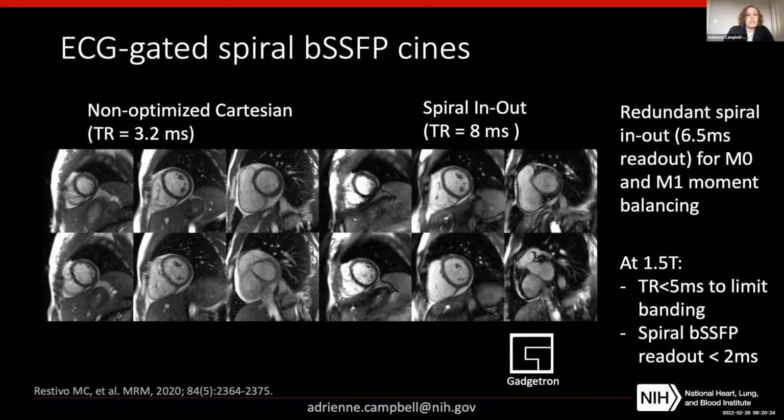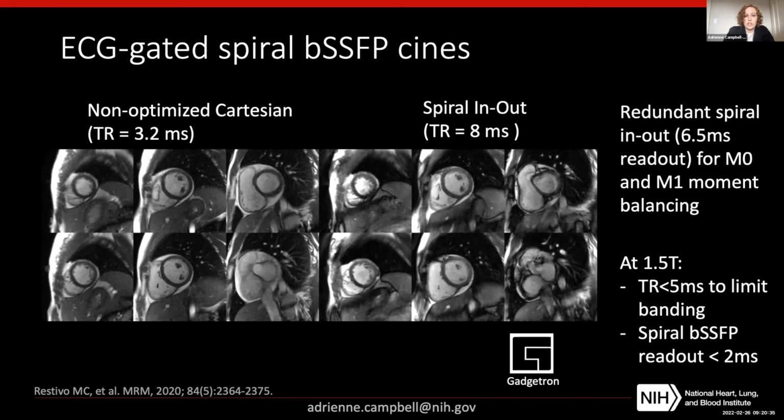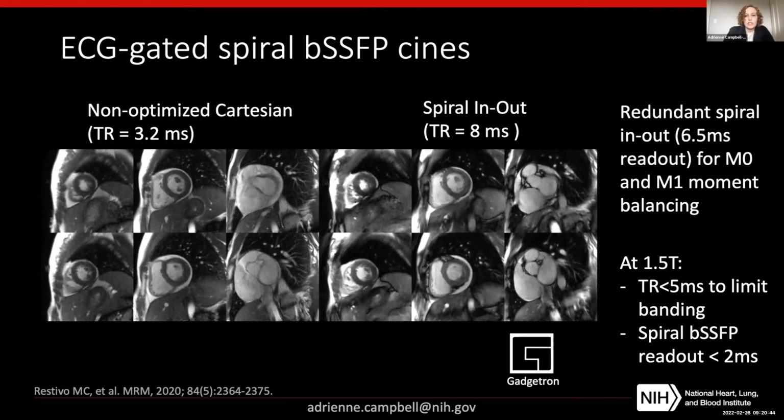In parallel to these validation studies, we've also been focused a lot on developing spiral imaging for 0.55T. We consider spiral imaging to be an important part of the puzzle to get 0.55T to be clinically adopted for cardiac MR. Spiral imaging is very SNR efficient and it works remarkably well at lower field strengths. And so if we pair that with our advanced reconstruction techniques, we think we can improve image quality a lot.